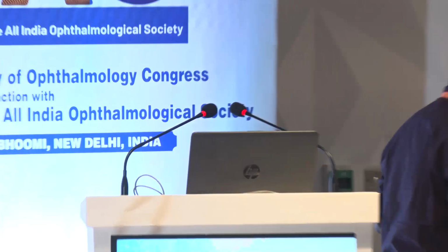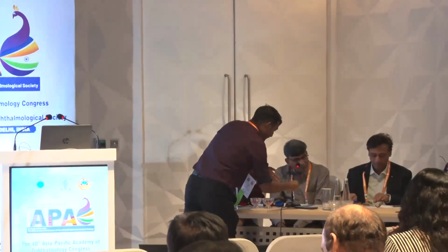Thank you, John. Can I ask the judges one question, please? How do you grade the stereopsis? What is the marker you have for grading? So you have to measure the stereopsis in seconds of arc. Right now the images I put in these tests are at 300 seconds of arc. If you put different images of different grades of stereopsis, you can go to finer and finer stereopsis until you can stop at where the patient can see.